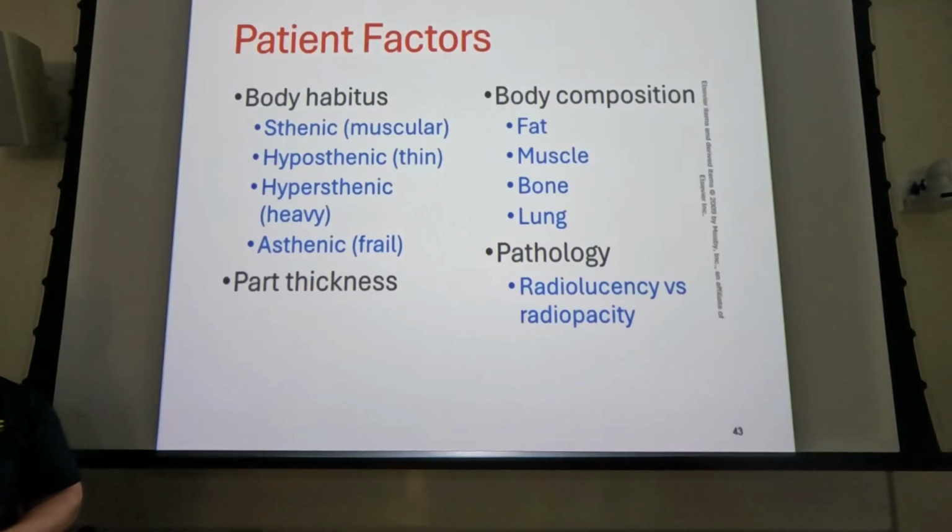Okay, so the things that used to affect our contrast and our density on our image really don't so much anymore. You can affect those things, and primarily how you affect those things is really screwing up your technique. What you might get is, if you undercollimate and you have a lot of direct exposure to the image receptor, your machine can't really figure out what you're doing, then you get an error in the reconstruction of your contrast.